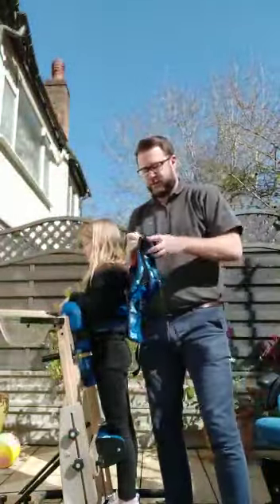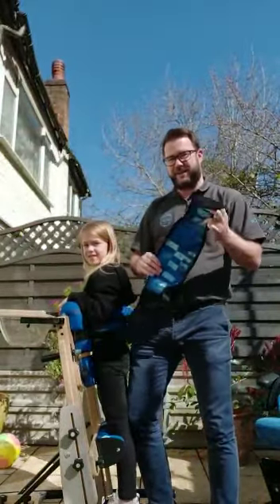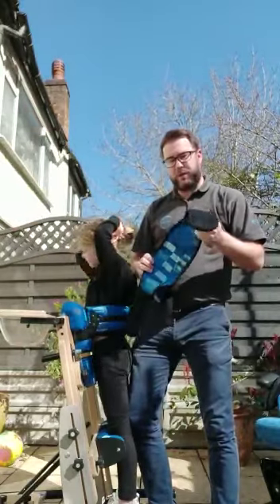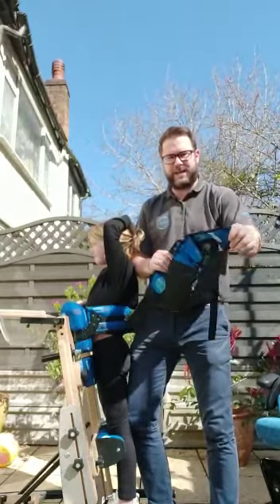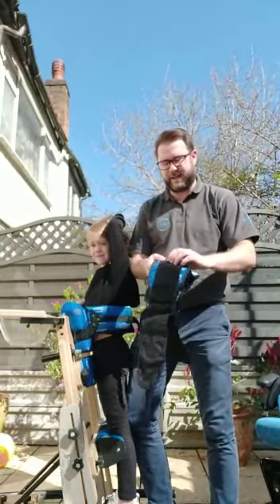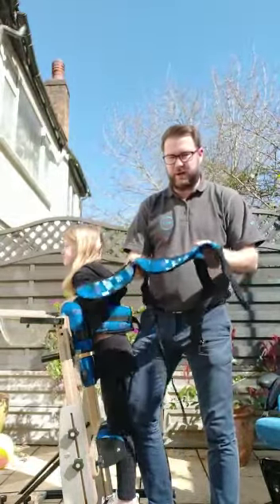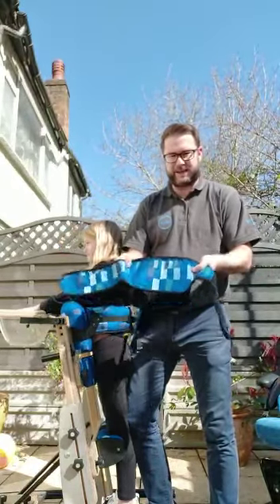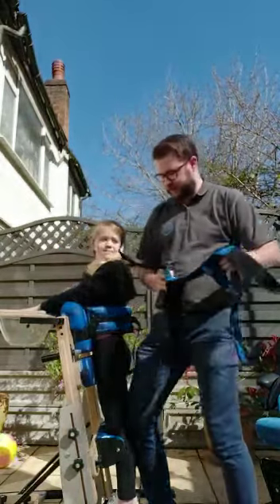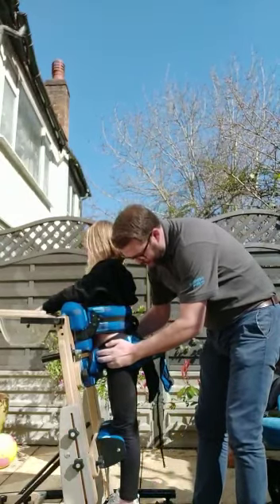I've got the lap strap here. Some people get confused with how to put it on. I like to leave it on last because Bella's leaning against me, and it's easier to do in a standing position rather than seated. This goes around Bella's hips. On our lap straps, you can see there's an X — I always say X marks the spot so you don't get confused. You're aiming to get it in the center of their hips and their bum.